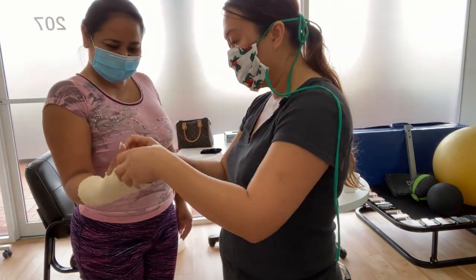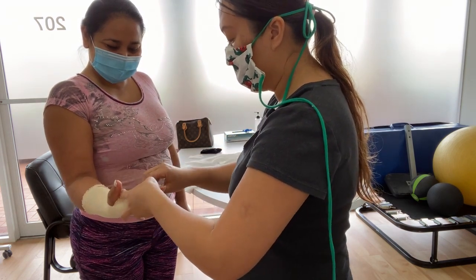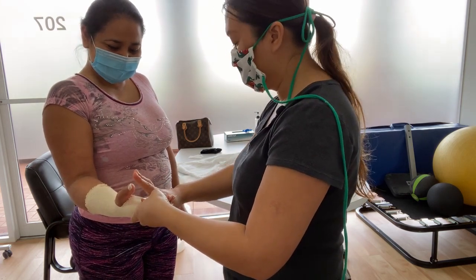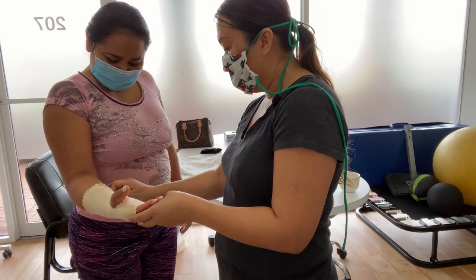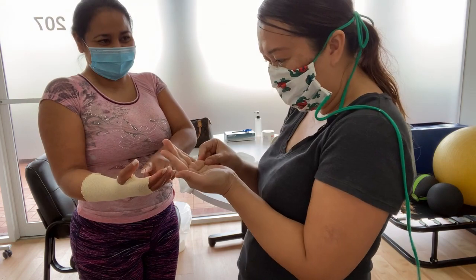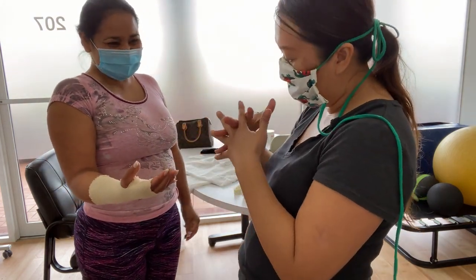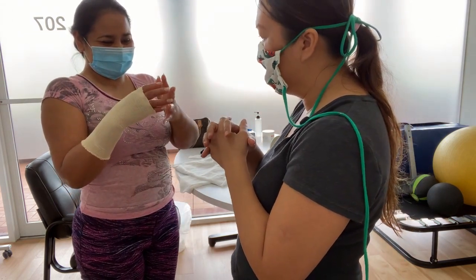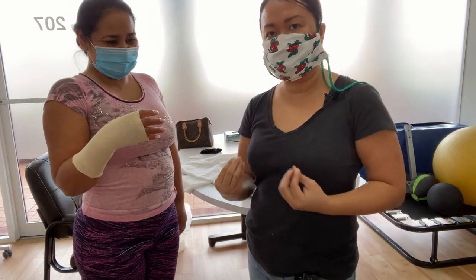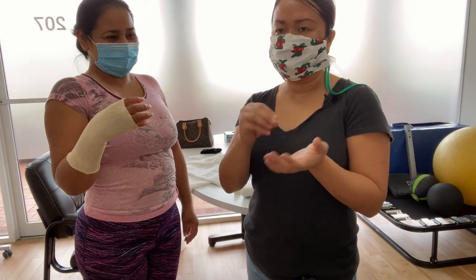I want to make sure I pull it up so that it covers your big knuckles — covers your big knuckles — so it gives compression. The reason why I don't like you wearing this all the time is because the compression and the buckle is getting out and they can move it for the next day. You've got to make sure that you get in between there. The compression helps her feel good, helps with the swelling, helps to cover up the stitches so it doesn't get caught and she doesn't feel pinchy.